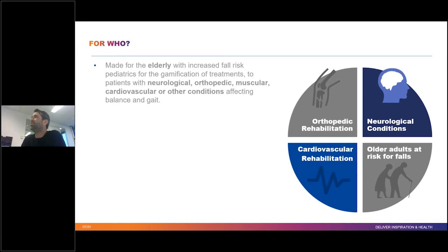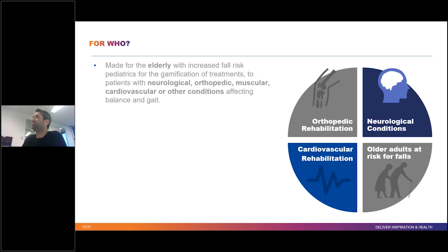The cmail is an instrumented treadmill which allows you to measure the spatial-temporal parameters — the quality of the walking pattern — combining that with augmented reality projected on the walking surface and virtual reality in front of the patient. It is specifically designed to support patients with impaired walking conditions. Elderly patients with an increased risk of falling can benefit from this device because they learn how to respond to environmental changes like obstacles or cues being projected on the walking surface or in front of the patient.